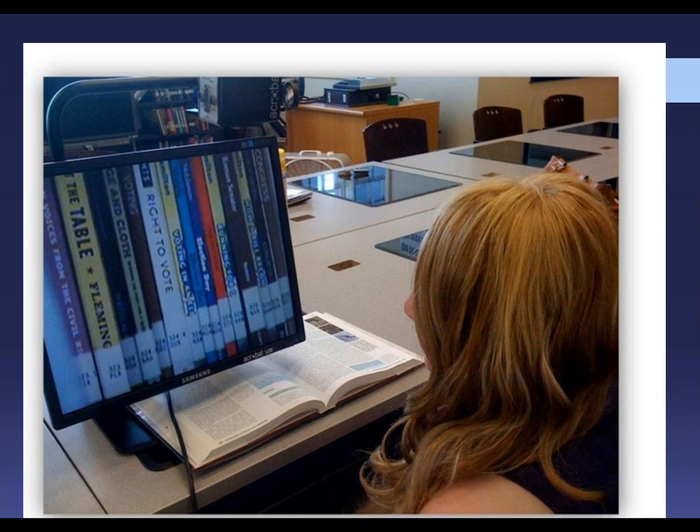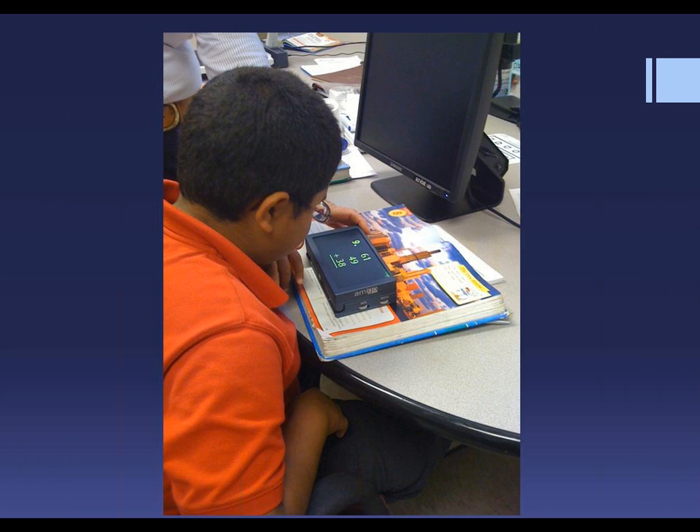This young lady has albinism. She's never been able to see the board or look at books on the bookshelf from her desk. This picture shows her checking out books on the bookcase across the room with the Acrobat. The Acrobat has a three-way camera so she can read books at her desk, take notes, and she can even use it to apply makeup — which is a good thing if you're young and cute like she is. This young man is using the Amigo to read his textbook. Notice the two wheels on the side for increasing the size and changing the color, and there's a writing stand that comes with it. It comes with two batteries that he charges at night so he never has to worry about his battery running low at school.